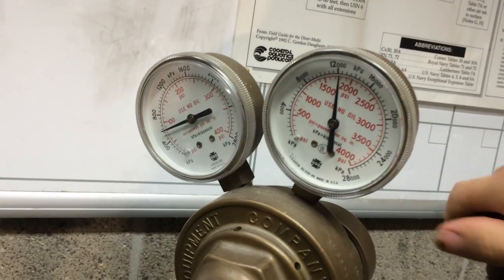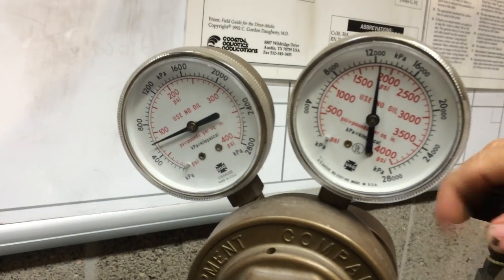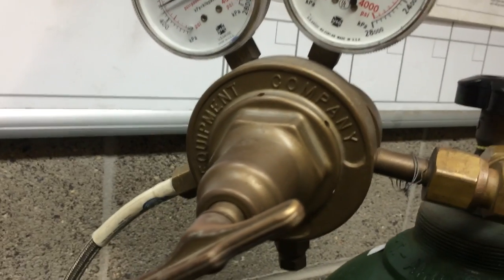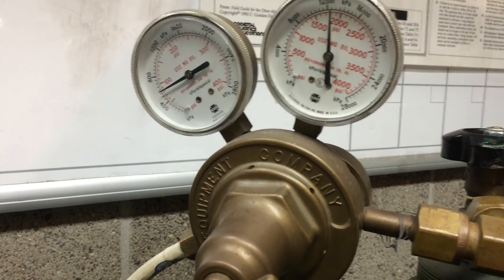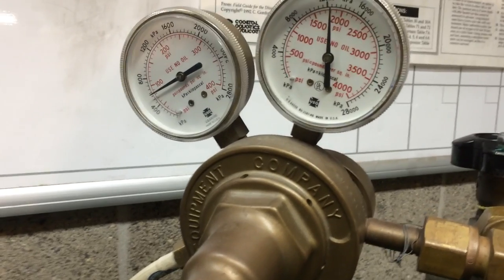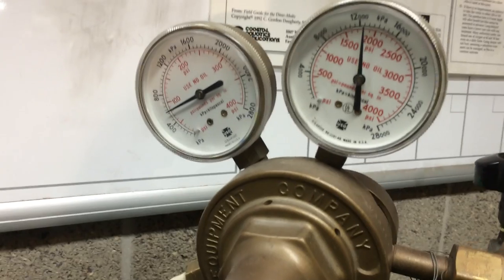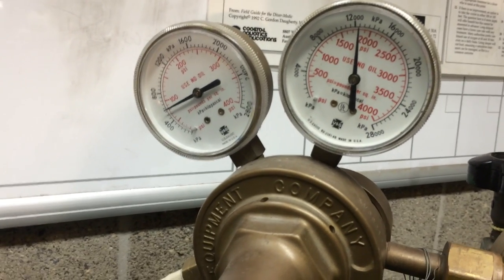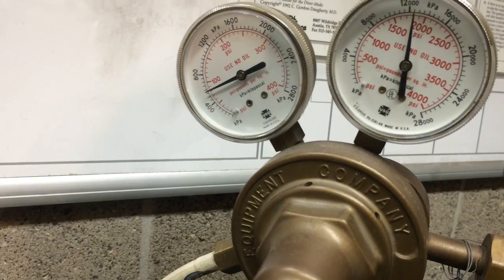Verify you have high pressure. This particular cylinder has 1700 psi in it. We then come into our regulator — this is a standard Victor welding regulator — and we use this to reduce the high pressure down to a secondary pressure which can be delivered inside the chamber.